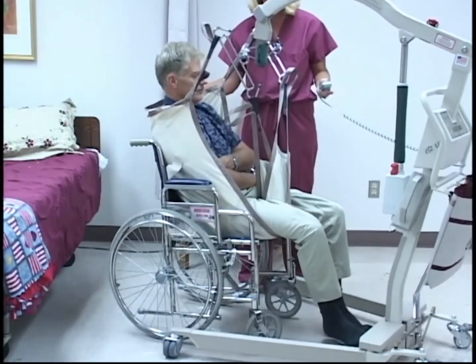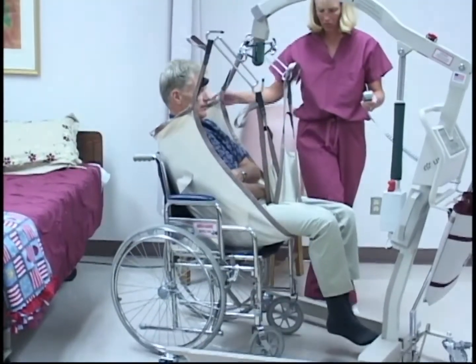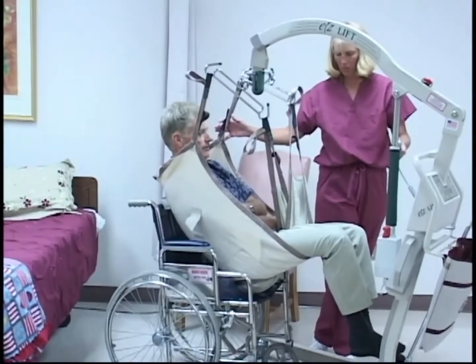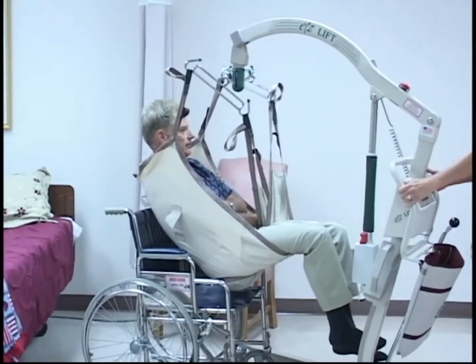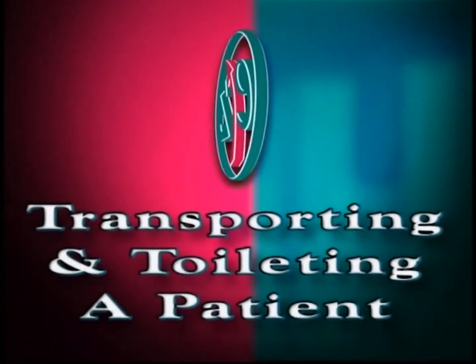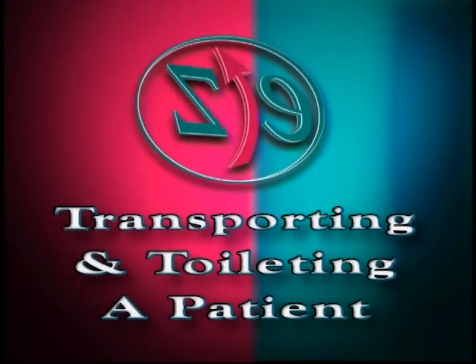Then smooth the sling's wings under the patient's thighs with a slight pull on the outside seam of the wing. Lift the patient off the chair. Once the person has been lifted, they are ready to be transported.